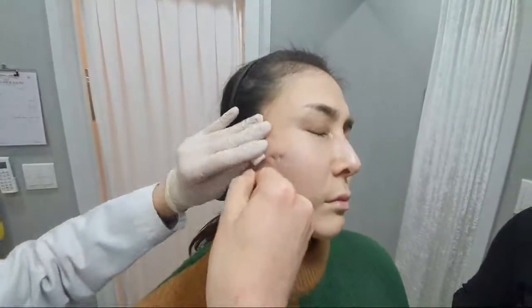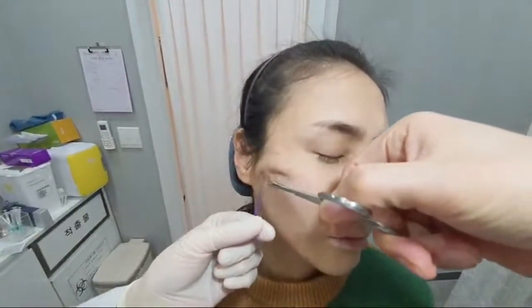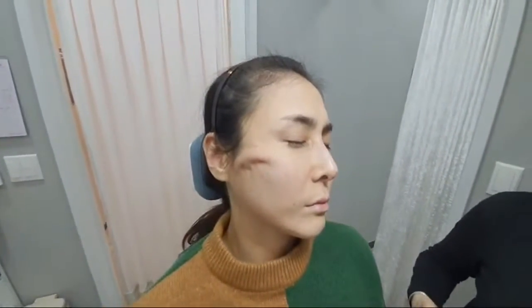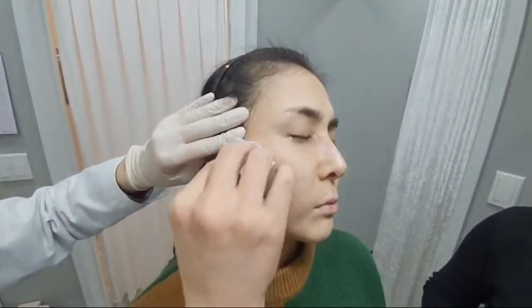The thread that Dr. Rowe prefers to use is called Tencog, which is an asymmetrical PDO thread, which is bidirectional. It's asymmetrical, and therefore it has the best anchoring ratio. See that 2 centimeter hangs up in the temporal area, and then the rest 6 centimeter hangs down.